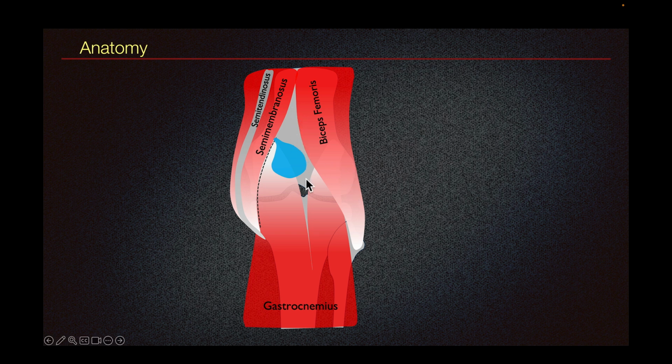Here we have distal femur, proximal tibia, fibula. Medially we have the semimembranosus muscle and semitendinosus tendon on top. We have medial and lateral head of gastrocnemius and biceps femoris. There are multiple types of cysts and masses that can occur in posterior knee, and for a cyst to be a Baker's cyst, it has to originate between the semimembranosus and the medial head of gastrocnemius muscle.